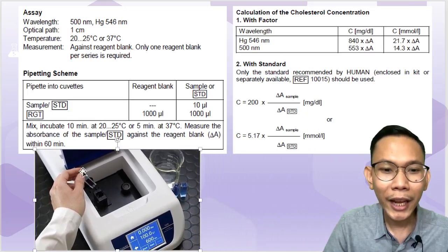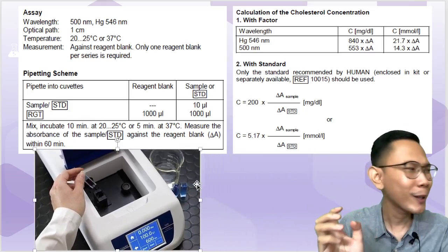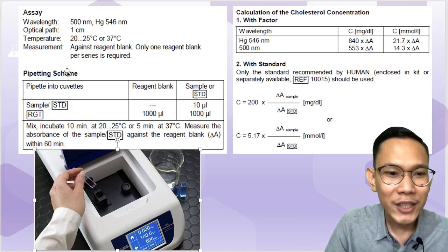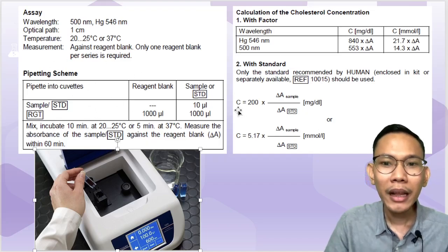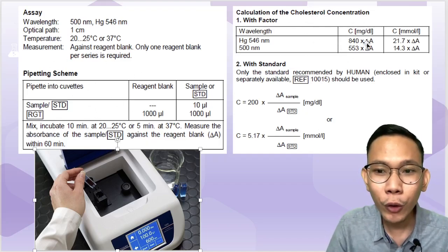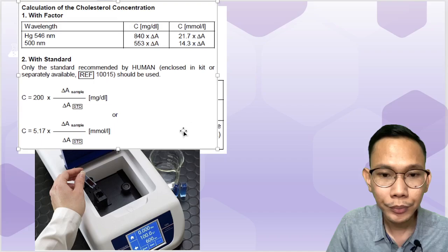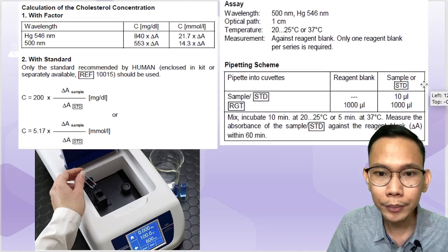I hope we were able to imagine that. I know it's hard to imagine, but somehow you got the pipetting scheme. Now, how do we calculate for your cholesterol concentration? Let's enlarge this. Let's flip it.